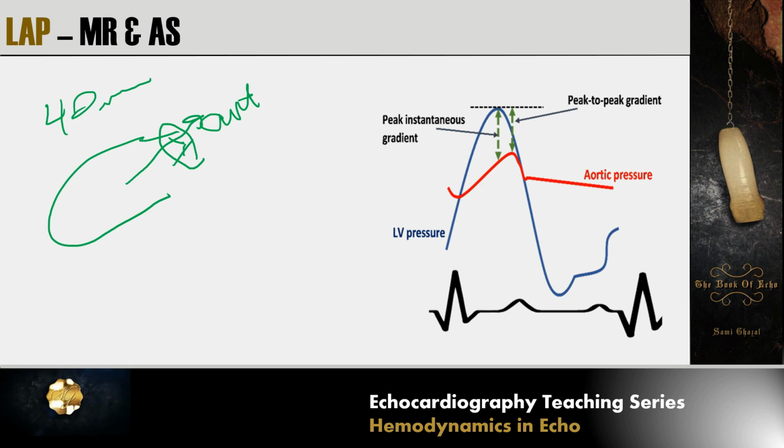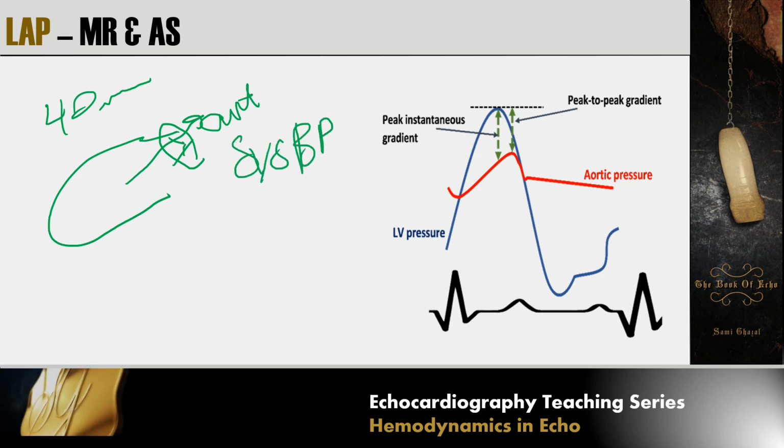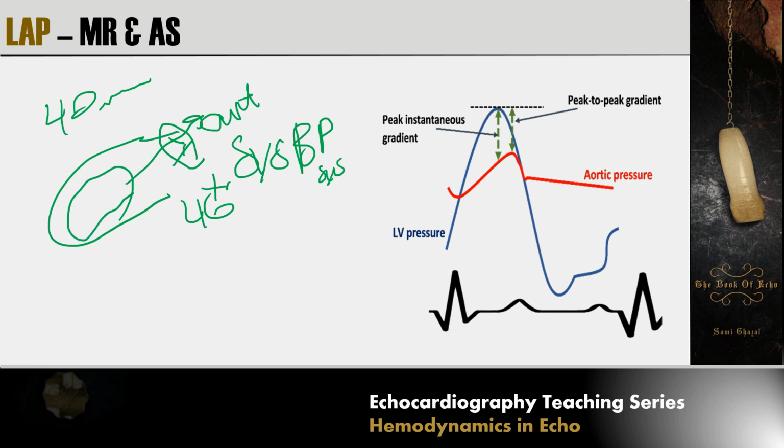However, it is not correct just to add systemic blood pressure in systole plus this 40 to get the LV systolic pressure. This is not correct. I will tell you why.